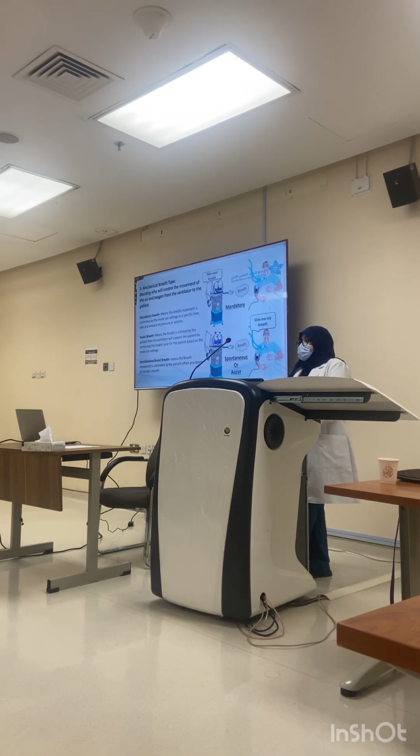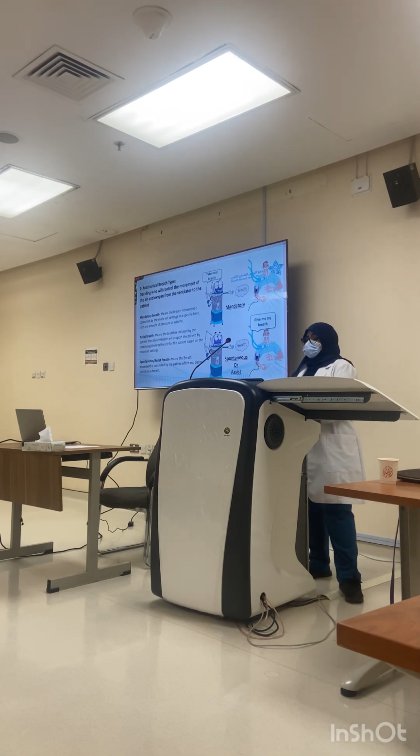The second classification we have is mechanical breath type. We have three basic breath types mechanical ventilation will give to the patient. We have the mandatory breath, we have the assisted breath, we have the spontaneous breath. The mandatory breath is basically a machine breath. It's a controlled breath. The machine is controlling when to initiate the breath, when to end the breath, how to cycle the breath, everything. The machine is controlling the breath based on set settings.